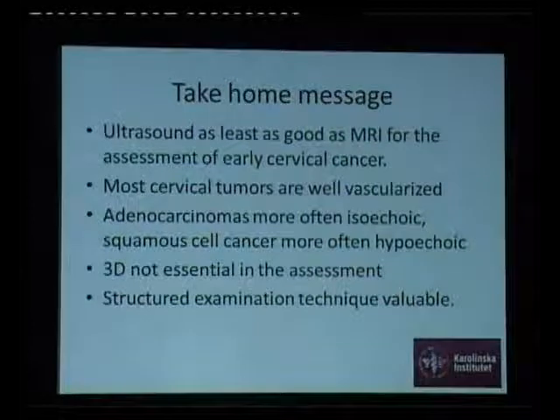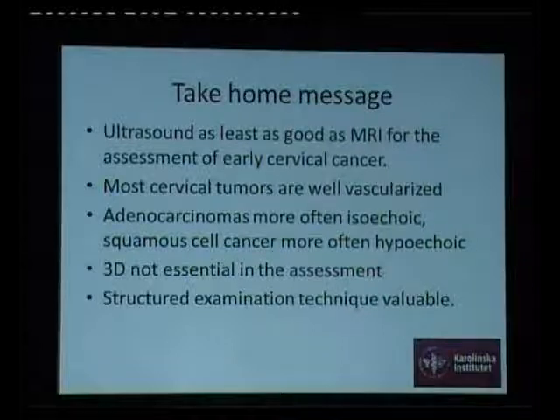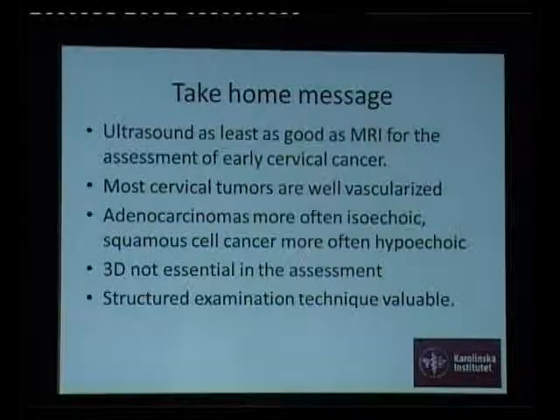The take-home message is that ultrasound is at least as good as MRI for the assessment of early cervical cancer. Most cervical tumors are well vascularized. Adenocarcinomas are more often isoechoic, whereas squamous cell cancers are more often hypoechoic. 3D is not essential in the assessment, but it can help you to assess the parametria. And a structured examination technique is valuable.